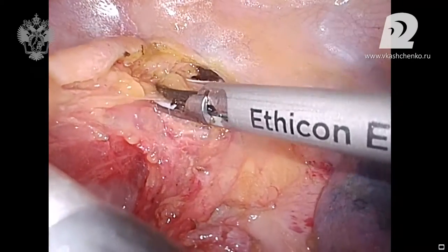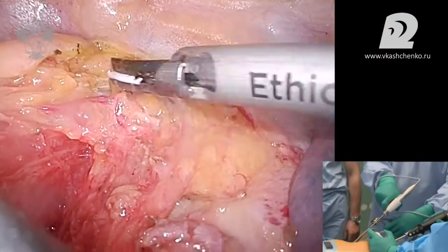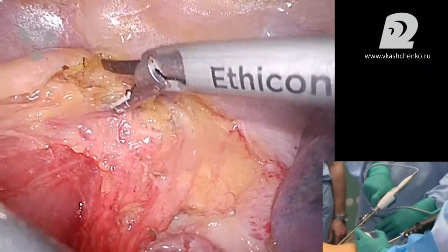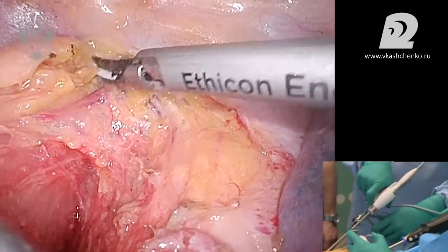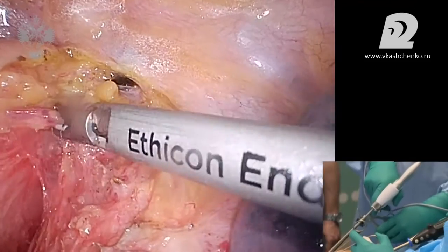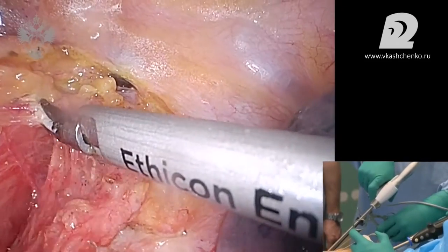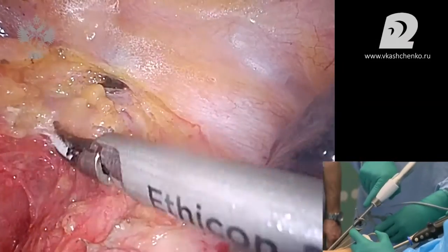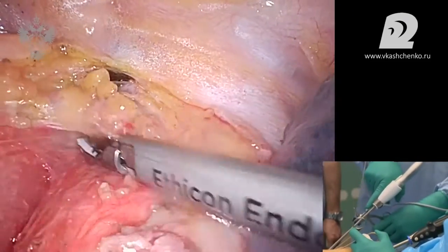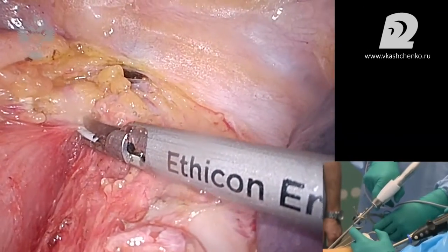Our task is to move between the trachea and esophagus. That's why the majority of the surgeons avoid the upper thoracic area, because everything is very dense here. And if there is a penetration from the esophagus, it goes into the membranous part of the trachea, if there is this growing-in process.